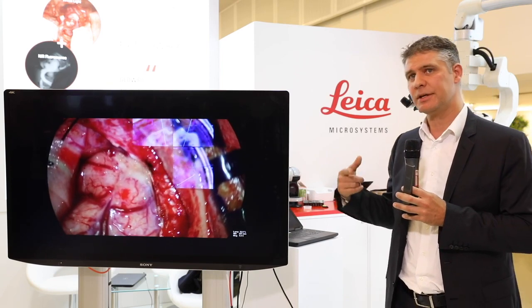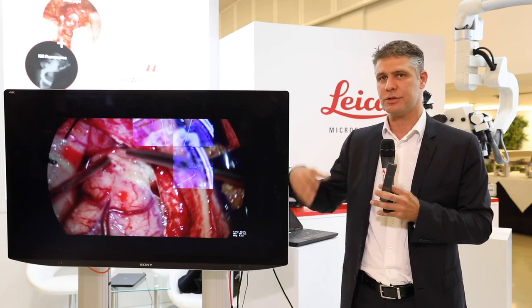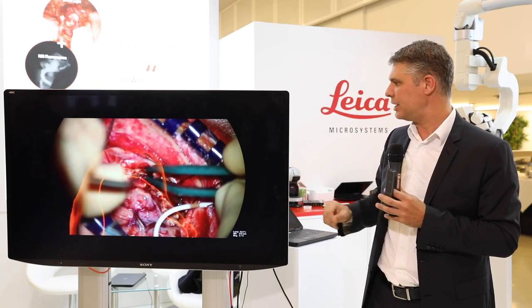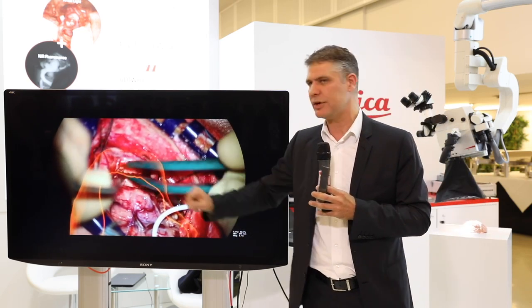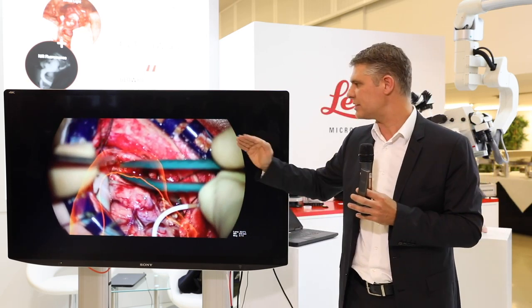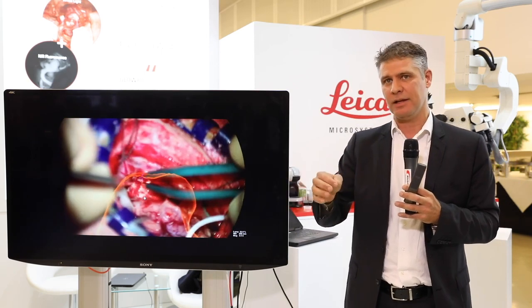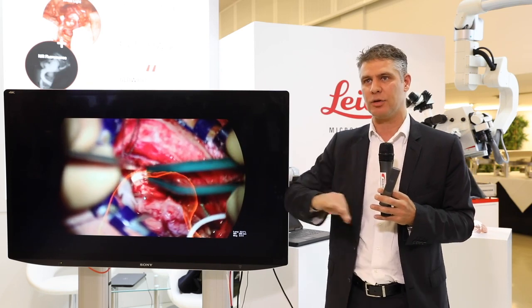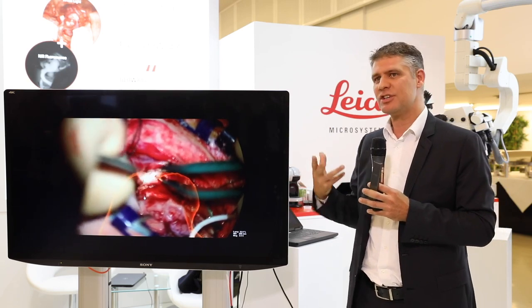You have different viewing facilities — you can see the whole shape in 3D volume rendering, or you can have the XYZ projections which allow us to understand anatomy as we are used to. You can project that on the upper side of your eye field. I quite like this 3D rendering where a line shows what is in the plane of focus and the rest of the image is what is below focus. You can follow the overlay and very nicely dissect the tumor.